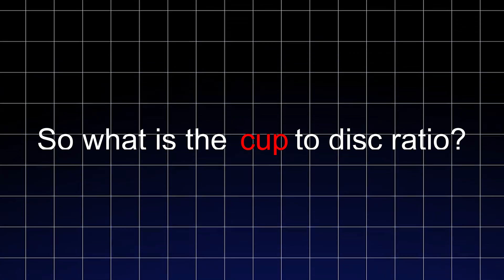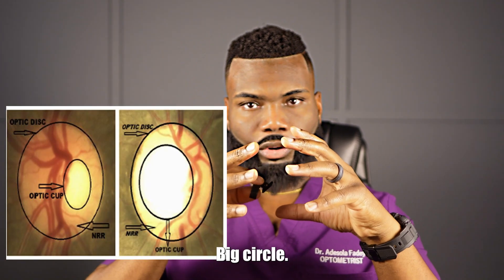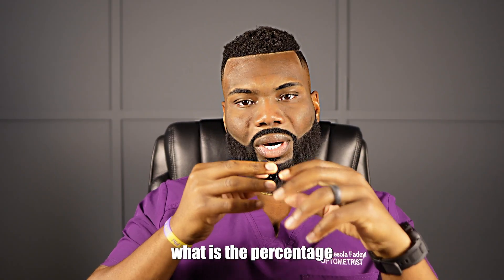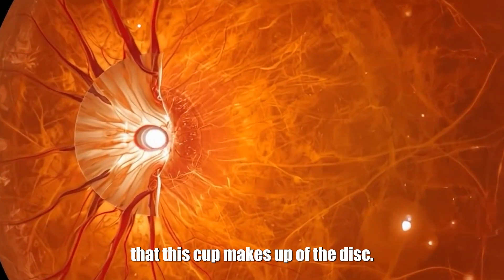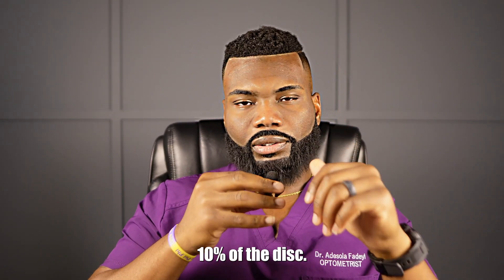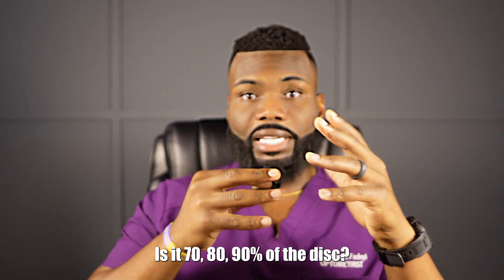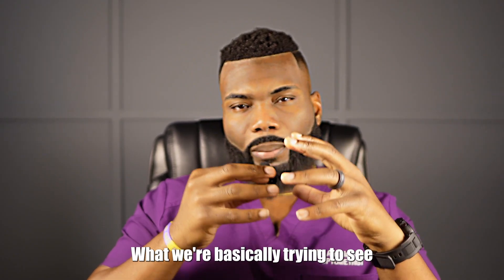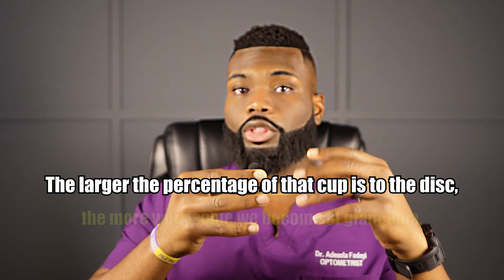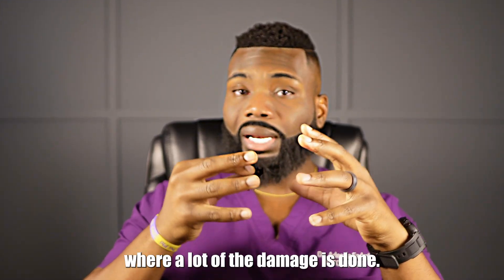So what is a cup-to-disc ratio? There's a disc, which is the outer circle — the big circle — and then there's the cup, which is the inner circle. What we're basically looking at is what percentage the cup makes up of the disc. Is this cup 10% of the disc? Is it 20%, 30%, 40%, 50%, 70%, 80%, 90% of the disc? The larger the percentage that cup is relative to the disc, the more worrisome we become about glaucoma, because we know that's where a lot of the damage is done.